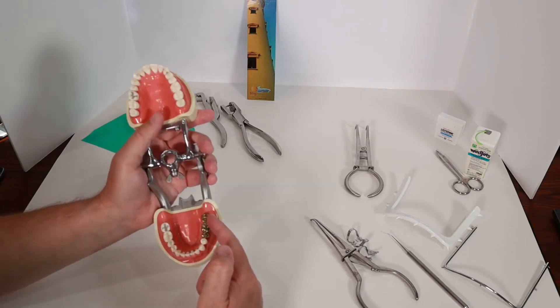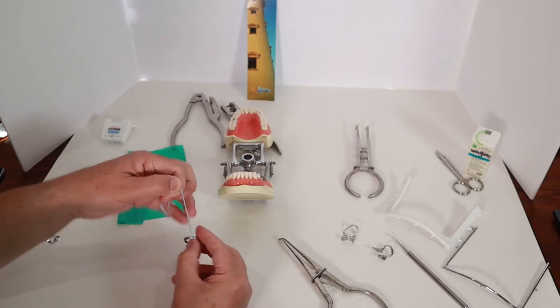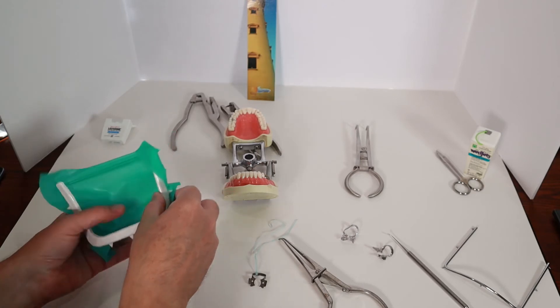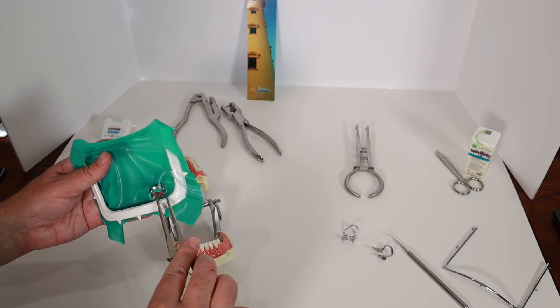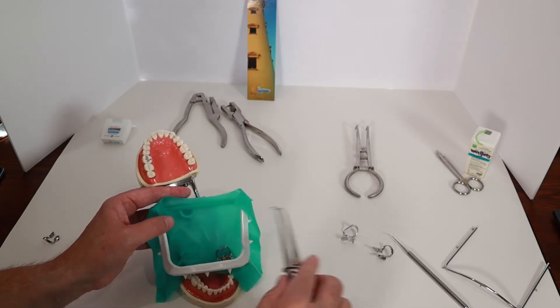Now I'm going to show you how I put a rubber dam on one tooth as well as multiple teeth. Say I'm going to work on the lower left first molar. I'll punch a hole in the rubber dam on the lower left. Next, I'll pick the clip I'm going to use and try it on the tooth to make sure it's the right size. I will then attach a piece of dental floss to the clip. Next, I place the rubber dam on the frame, then place the edges of the clip into the hole — this will hold the hole open while I'm placing the dam. Then I use the placing tool by sticking the tips into the holes in the clip, bring the whole thing over to the mouth, open up the clip, slip it onto the tooth, then close the clip onto the tooth. I'll then push the clip down with my fingers so that it's securely on the tooth.